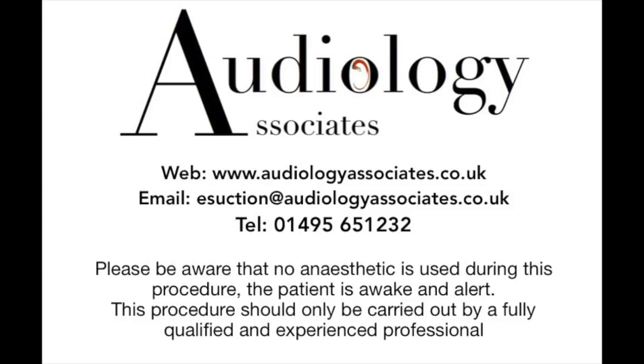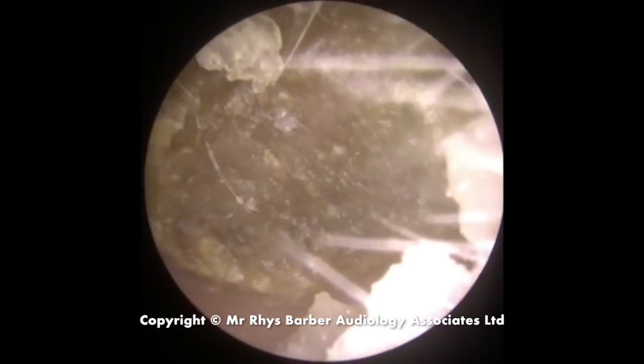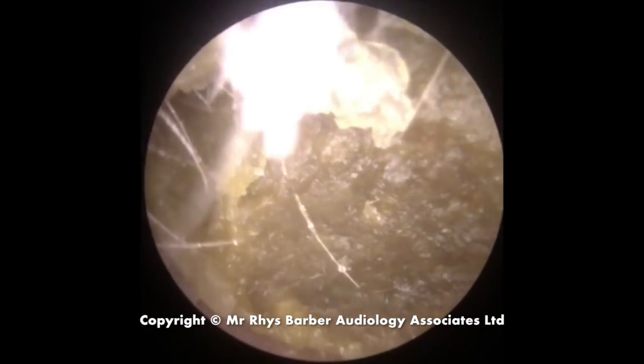Hi everybody, this is Rhys Barber from Audiology Associates. Thank you very much for watching our video today. We have a bilateral wax removal video for you — you can see there's quite a hard plug of wax completely blocking the ear canal.